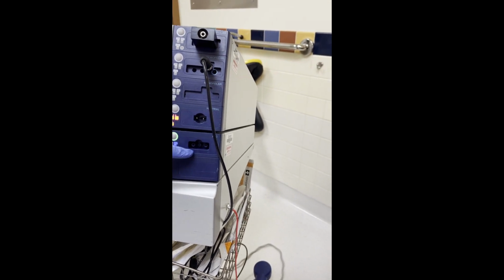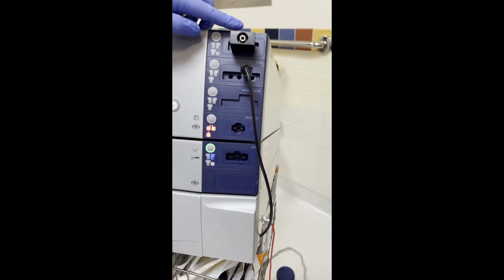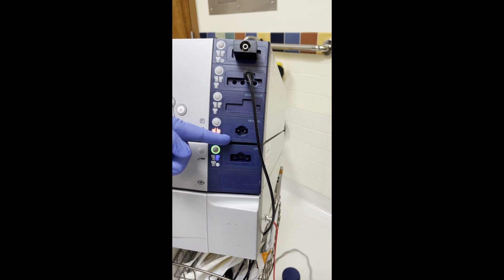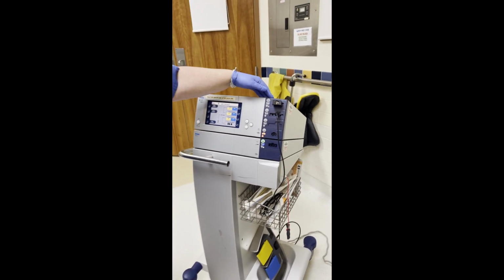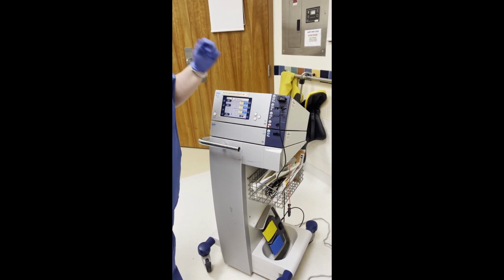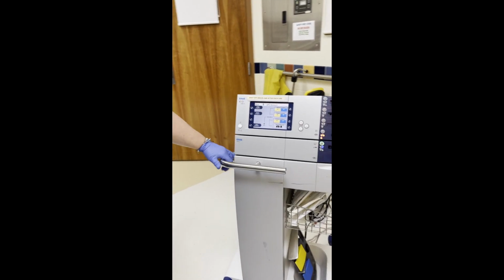And then APC. You're going to want to know about the APC down here, and the bipolar up here. The rest of this you don't need, other than your grounding pad. But anyway, leave this alone, leave it in there, because we can't do our procedures without this. Maybe just show the argon tank. Yeah, we can show it again when we do that.